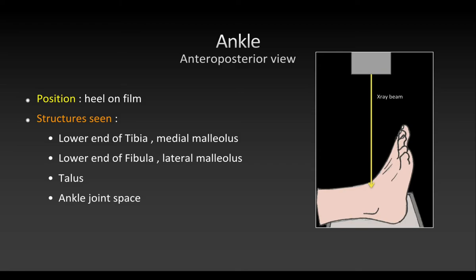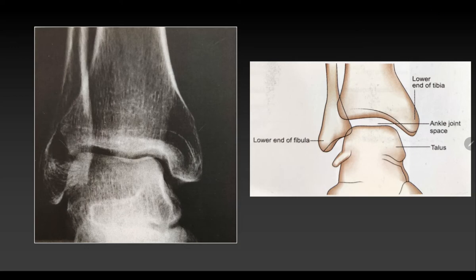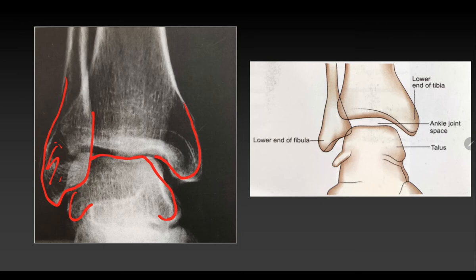For an ankle x-ray, the AP view can be taken. Usually three views are taken for the foot: AP, lateral, and oblique, but we will focus on two views today. For the AP view, the heel is placed on the film. The structures seen are the lower end of tibia, fibula, talus, and the ankle joint space. On this image you can see the lower end of tibia, the medial malleolus, the lower end of fibula forming the lateral malleolus, the talus and its margins, and the joint space.